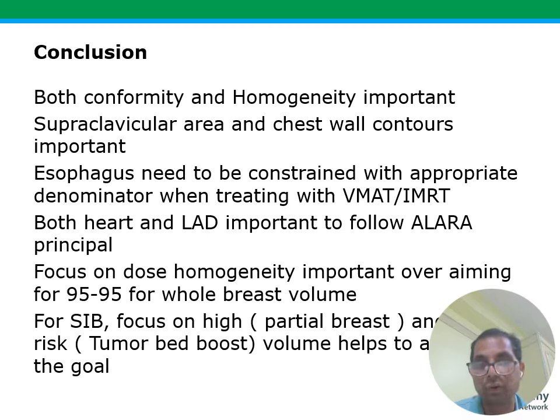And we do follow this in our own practice, and have noticed in many practices across the globe through peer review and workshop the lack of consistency in dose homogeneity, contouring of chest wall and supraclav, and dose to the heart and LAD. So this was the idea of having this brought up for the discussion, and hopefully this will help your practices with some of the practical guidelines which we discussed.